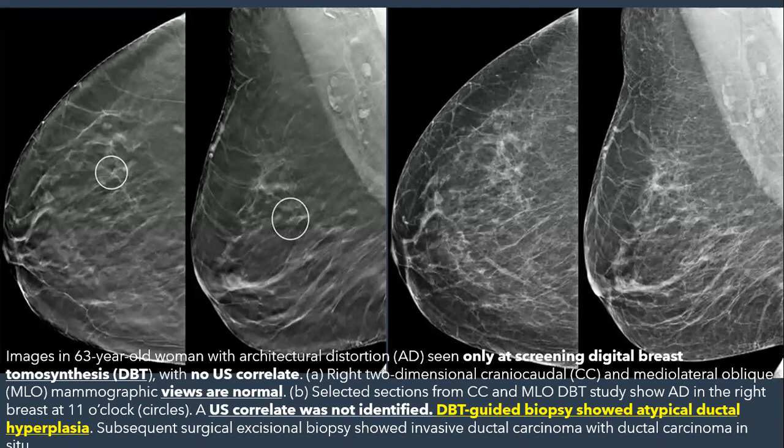That is why nowadays for screening they combine the 3D along with the 2D. And because of the radiation, they started to discuss synthetic 2D mammography. From the 3D, they are creating the 2D by post-processing, instead of exposing the patient twice, 2D and 3D. But at the same time, they are studying the advantages and disadvantages of this in screening mammography.